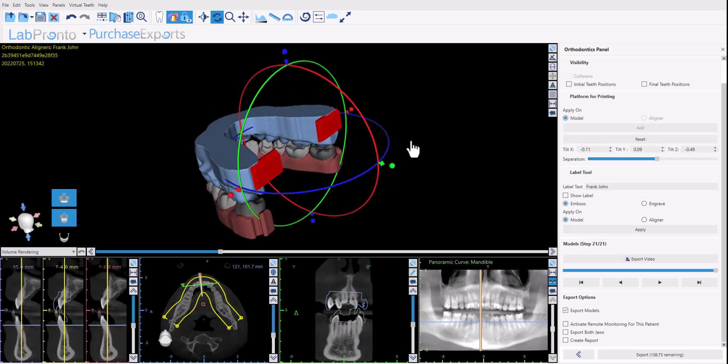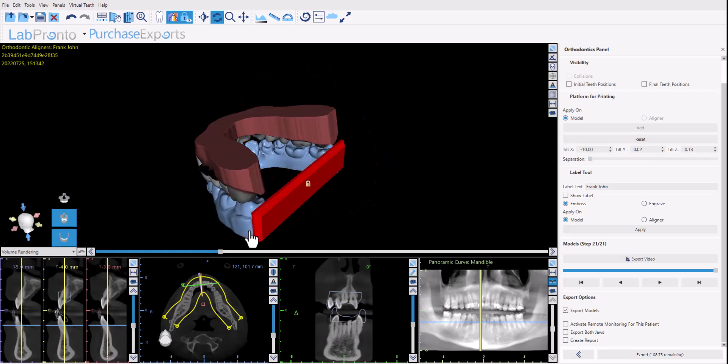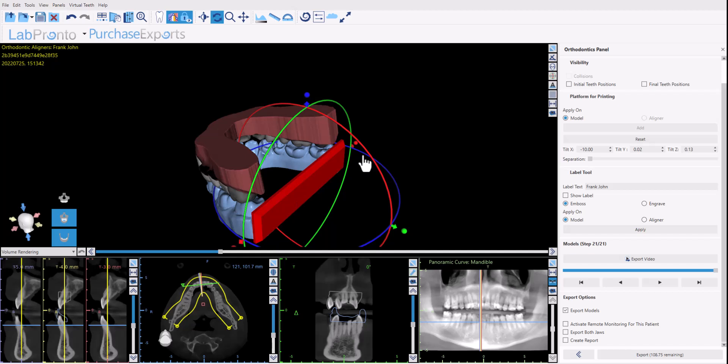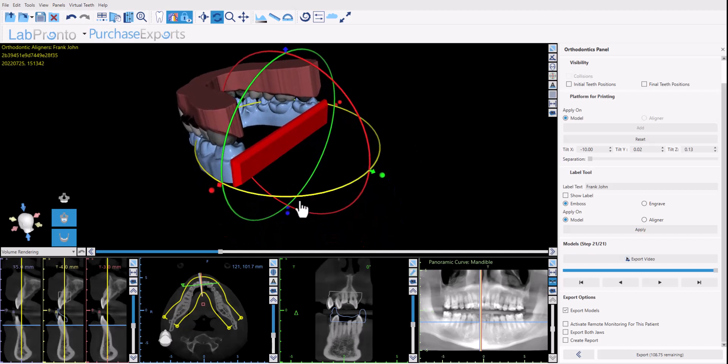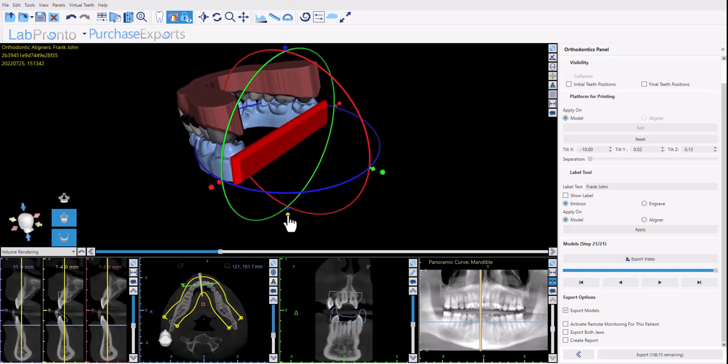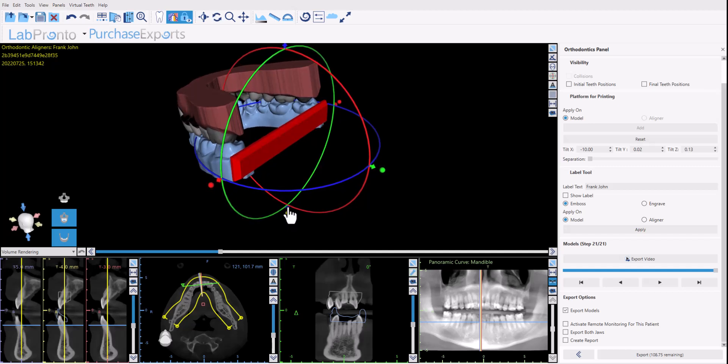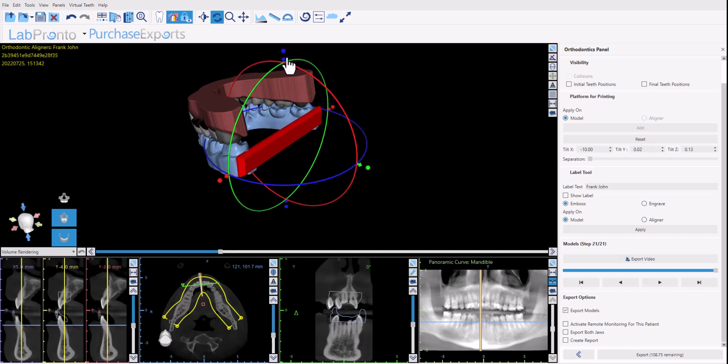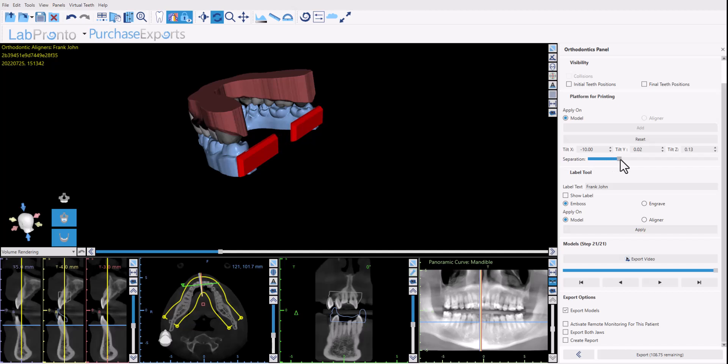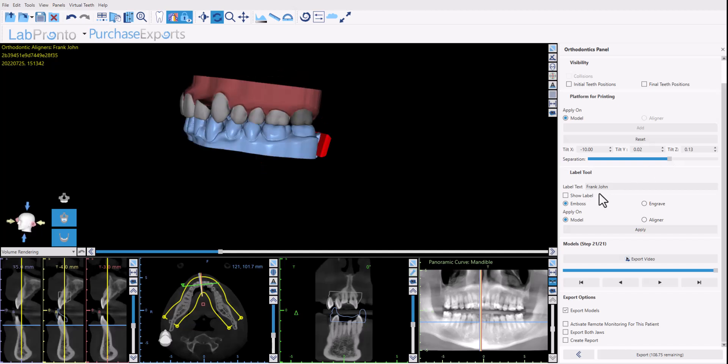Once you've completed the process for one arch, click on the other arch to activate it. Unlock the base. Make the necessary modifications. And of course this only needs to be done once for each arch and the base will be applied to all the relevant models.